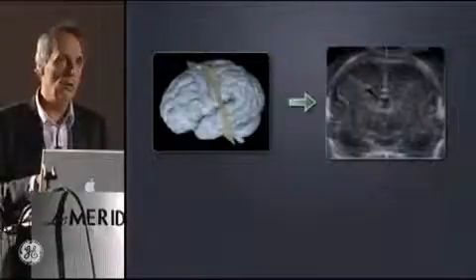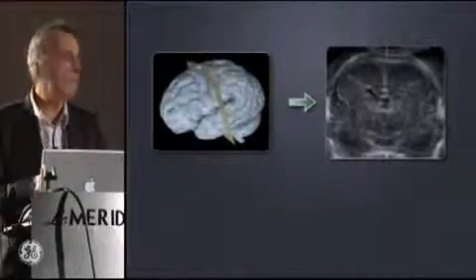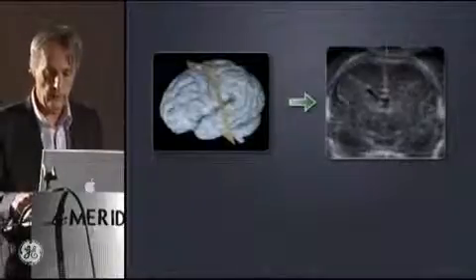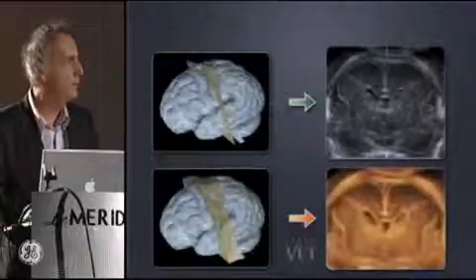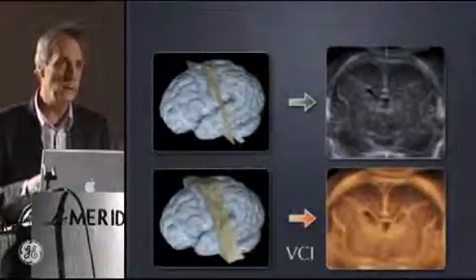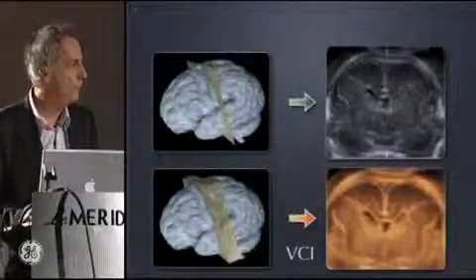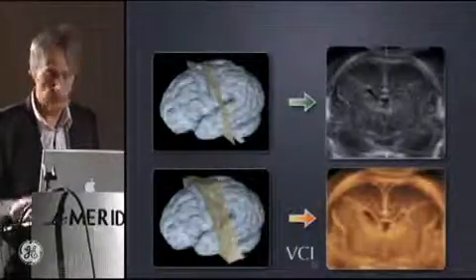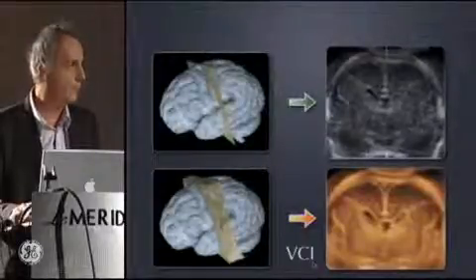When you want to do a section inside the block, you can choose also the thickness of the section, and you will use a transparency mode, and you can see the difference, and you can improve the quality of the picture. And the name of this is the volume contrast imaging.